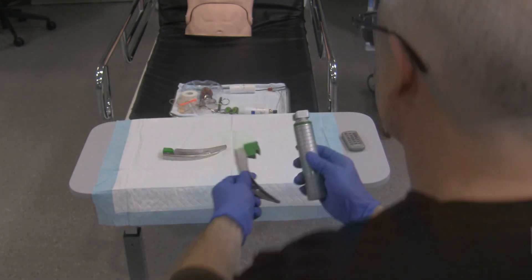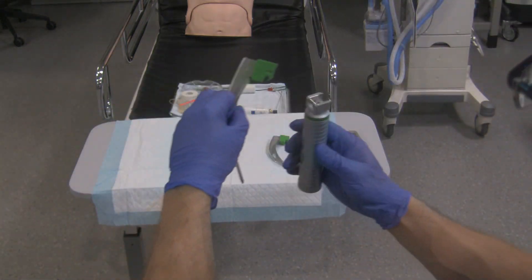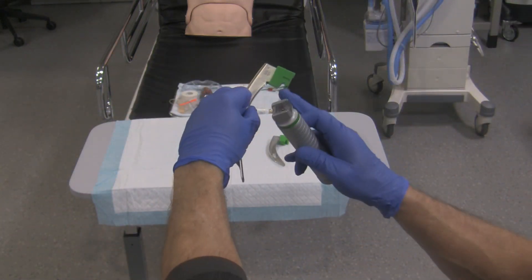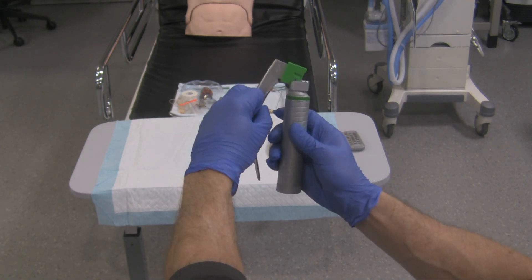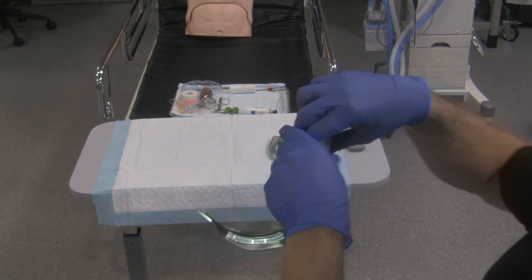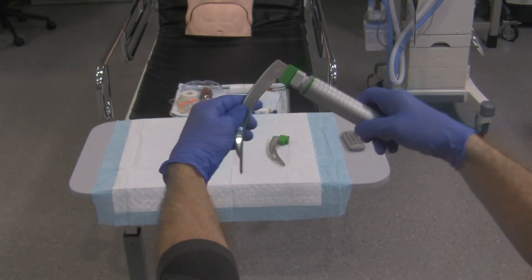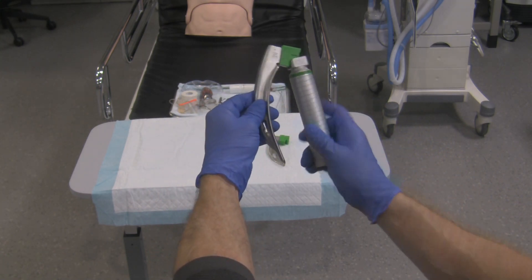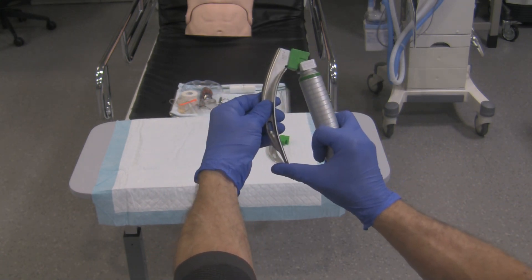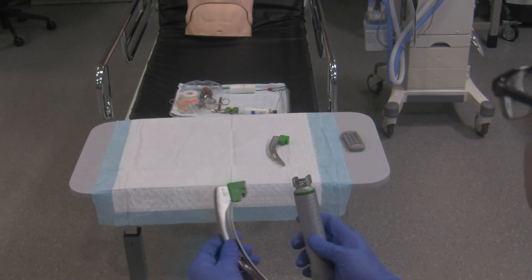We'll do it with the bigger blade just to make sure you've got it down. Grab the bigger blade, take the slot of the bigger blade, line it up with the bar of the handle like so, snap it on, and turn the device on. To detach, turn the laryngoscope off, put your thumb on the tip of the blade, push off — it comes apart rather easily and you're good to go.